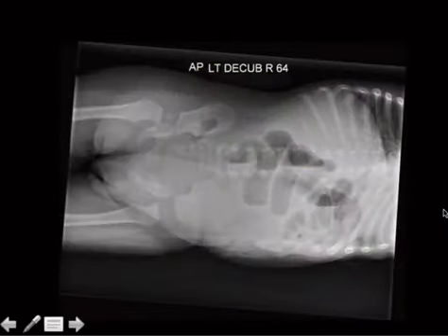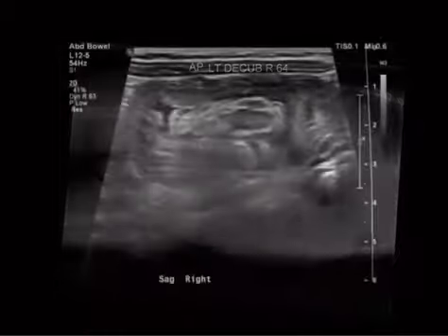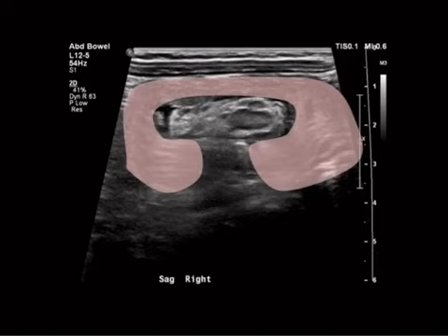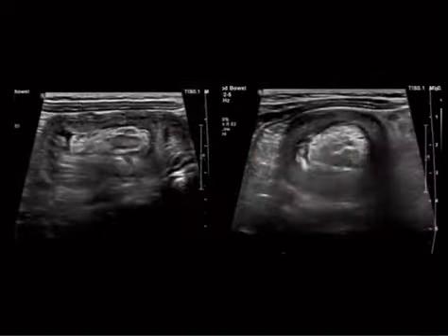So here's the next case, showing a small bowel obstruction, a bunch of dilated air fluid levels here, and then we're going to get an ultrasound and we're going to see that thing. It sort of looks like a kidney, all right? Maybe, can I convince you of that? This is probably the trickier way to show this pathology. When you turn the probe over, then it looks like a target, which is more obvious. It's an easier way to show it.